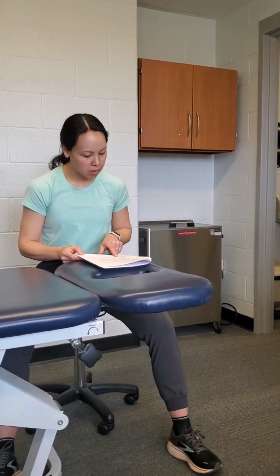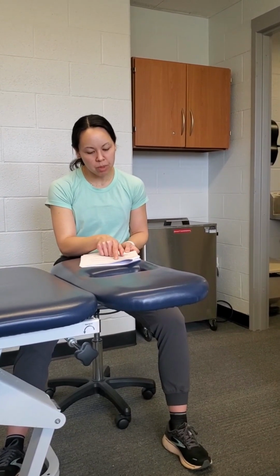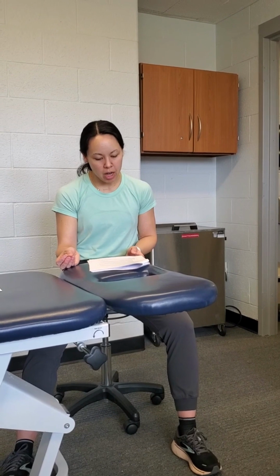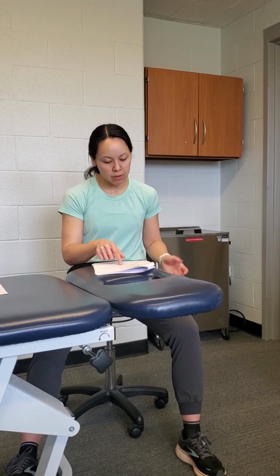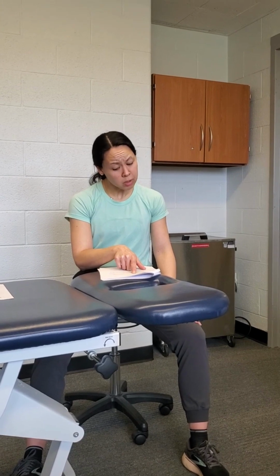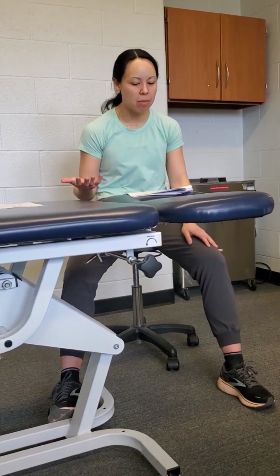If you flip over to the bold section though, where it says acute rehab, this would be good to talk about. Under acute rehab it says, when should we begin passive BFR post-operatively to combat that disuse atrophy? There are a few different studies that he talked about, but generally it's pretty safe. This one study by Noyes in 2021, they started at about 3 weeks post-op, but some studies are recommending as early as 2 days post-op. So honestly, if we're seeing that patient in the first week post-op and they're in a lot of pain, or they're just not moving well, do the BFR even passively, and that can help with muscle sparing quite a bit.